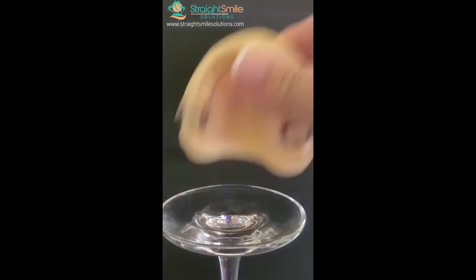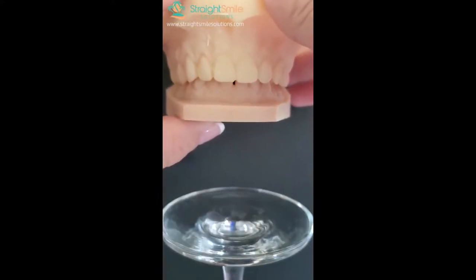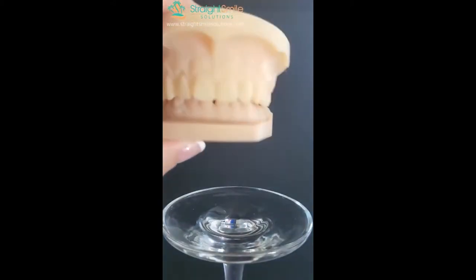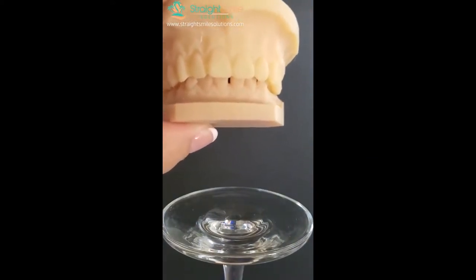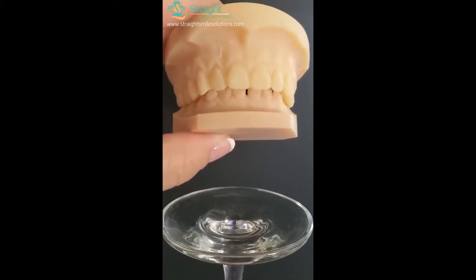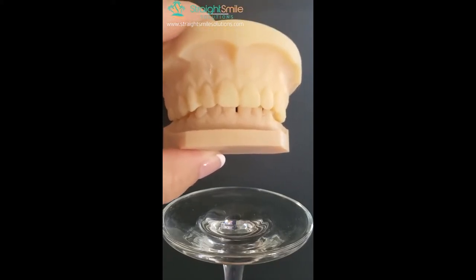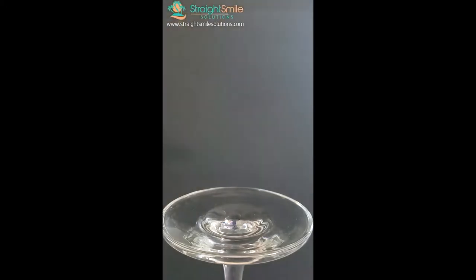You can see the difference the appliance makes — a deep bite of about 60 to 70 percent where you barely see the lower incisors. If you don't know much about overbites, understand that this will get worse over time, not better. You need to have confidence telling patients that. It's a progressive issue: over time the lower teeth will touch the roof of the mouth, causing fremitus and periodontal destruction. The younger the patient, the better it corrects.